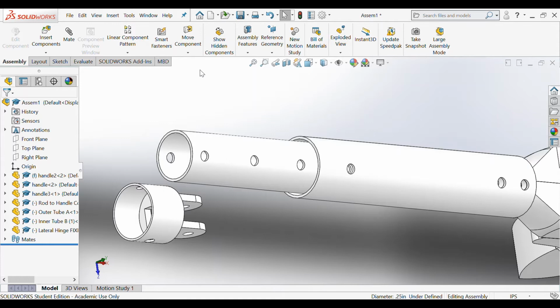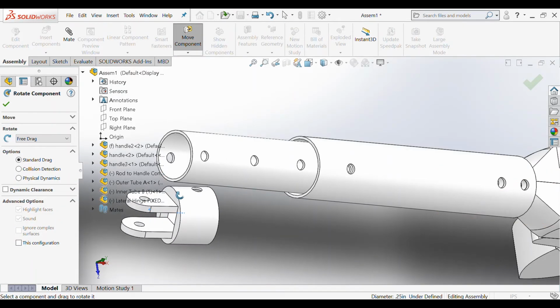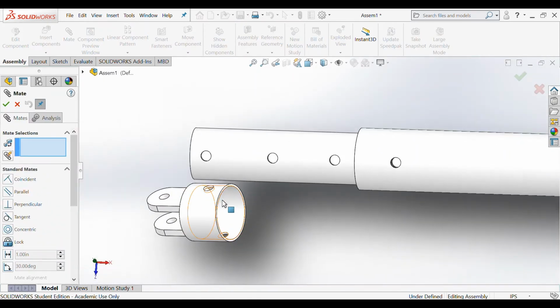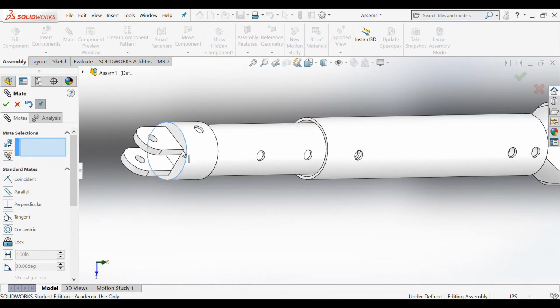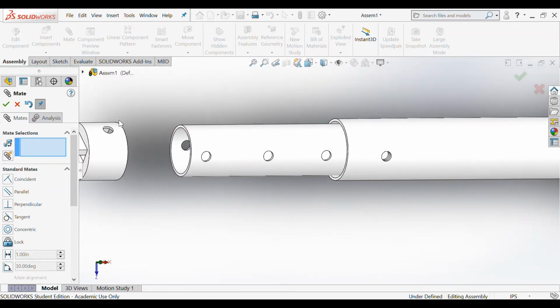I'm going to go on ahead and move this component. I'm going to mate the inner circle to the outer circle of the inner rod, and I'm going to make them concentric. So as you can see, you can move it around, but within the same circular motion.